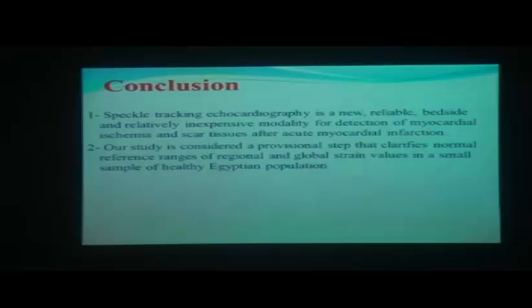Conclusion: speckle tracking echocardiography is a new, reliable, bedside, and relatively inexpensive modality for detection of myocardial ischemia and scar tissue after acute myocardial infarction. Also, our study is considered a provisional step for the clarification of normal reference range for regional and global strain values in a small sample of the healthy Egyptian population.